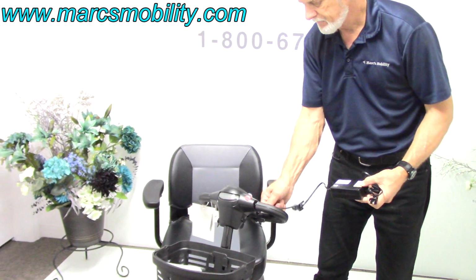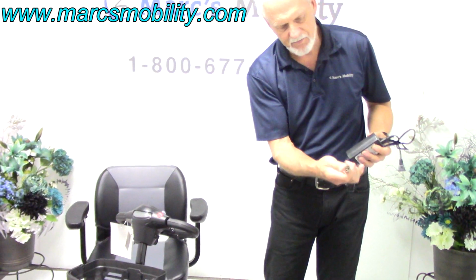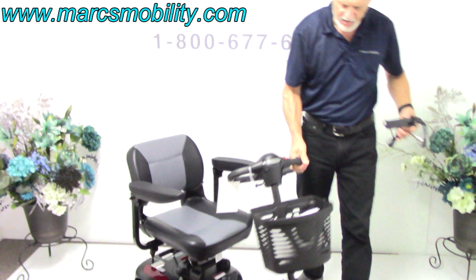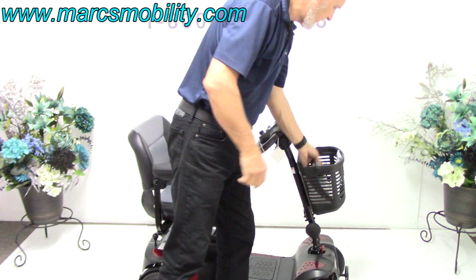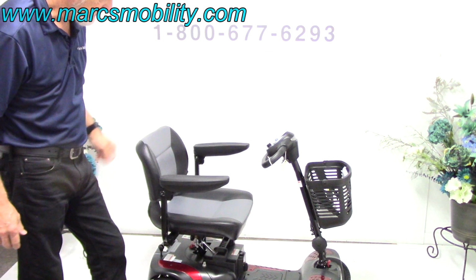Pull it out. Okay? When you pull it out, don't pull on the cord. Pull out from here so you don't damage the cord. I've had all kinds of stuff happen like that when you pull on the cord. It's not a good idea. So carry your charger with you when you're traveling, and you don't have to worry about running low on batteries.